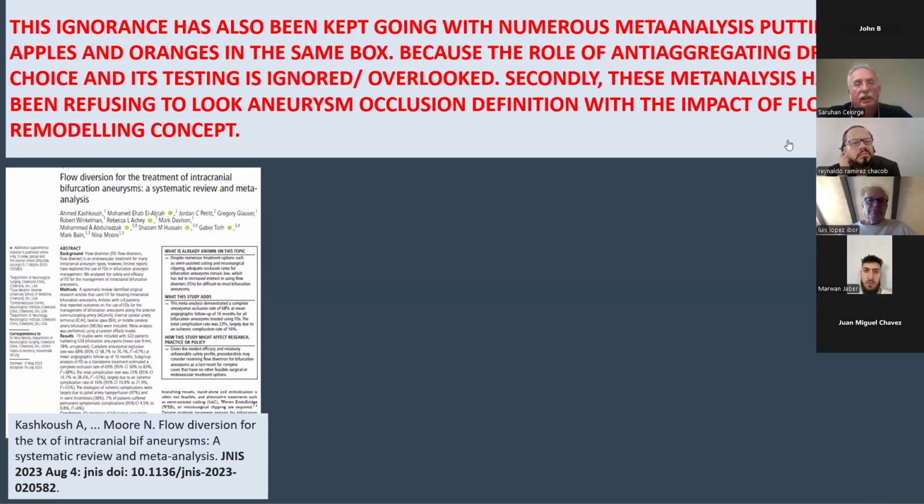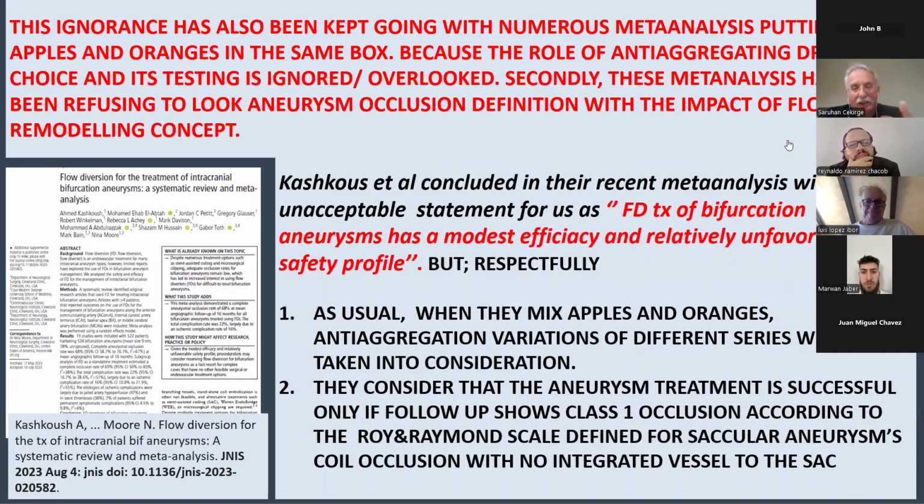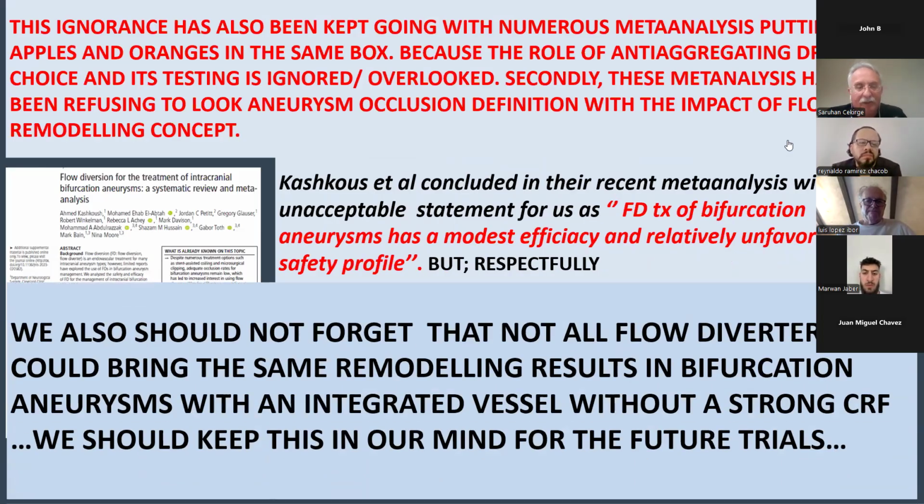And this ignorance has been kept going with numerous meta-analyses also. They put apples and oranges together. They never look at the role of anti-aggregation, and they come up with the result that flow diverters in bifurcation aneurysms have a modest efficacy and a relatively unfavorable safety profile.